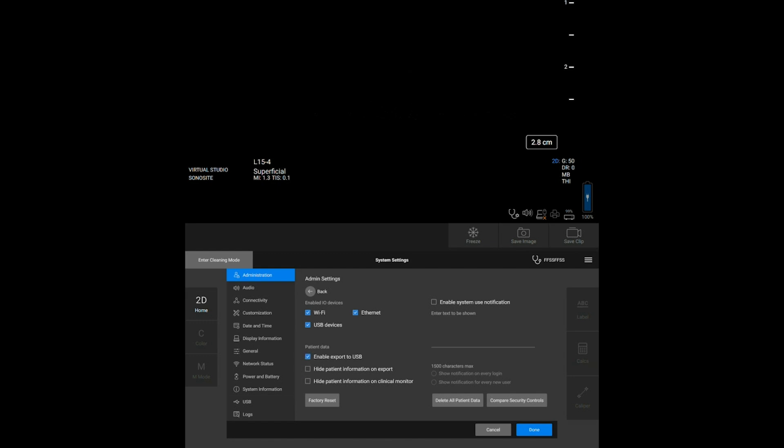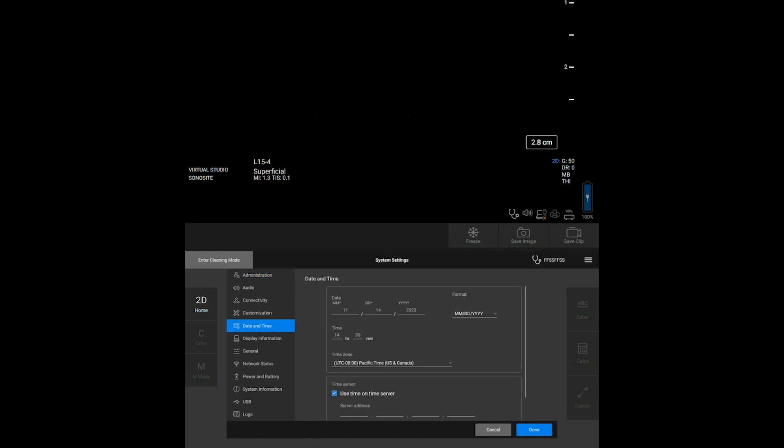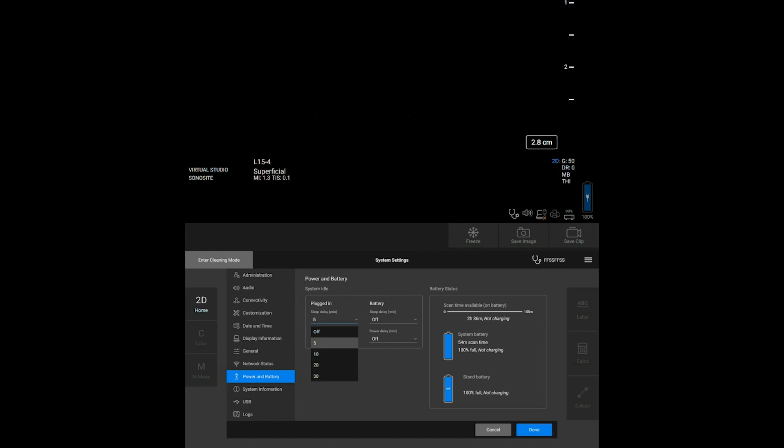Other system settings can be configured by any user. For example, adjusting the date and time. And then let's adjust the sleep mode to off.